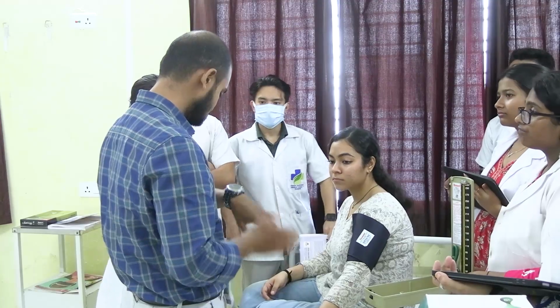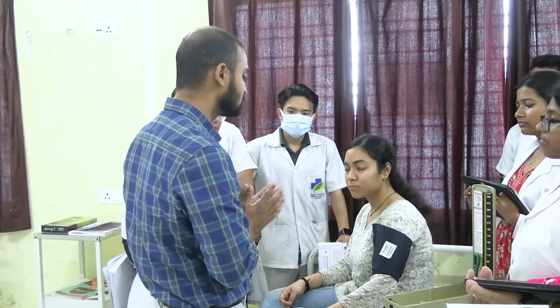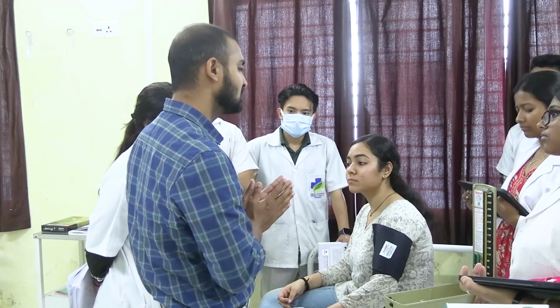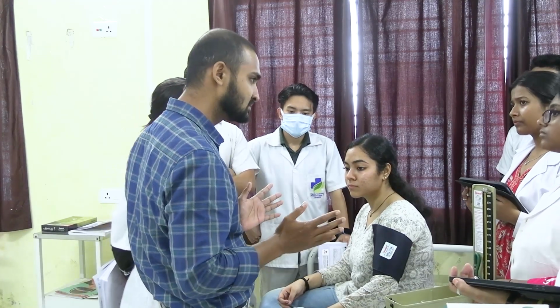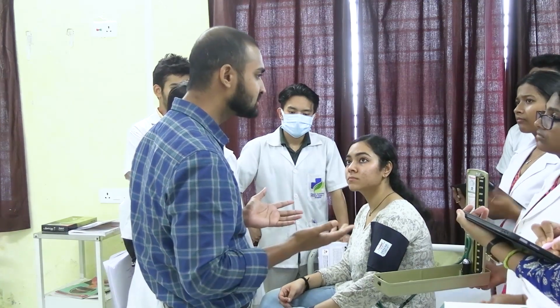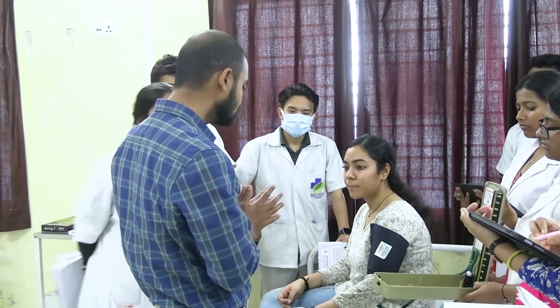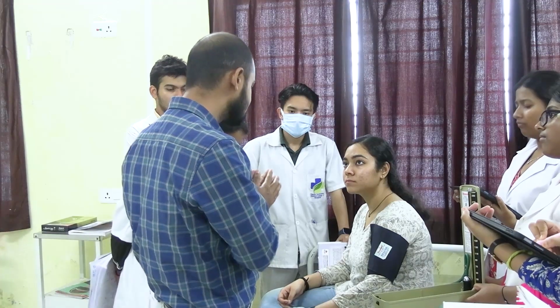So it is almost 5 minutes. Now she is in sitting position. You also have to see that the patient is not in anxiety and has not taken any medication, like coffee or tea, which can increase the BP. If she said that she has taken some medication or has some anxiety issue, at least 30 minutes should be given to her before measuring the BP.